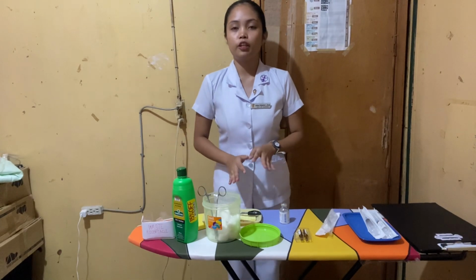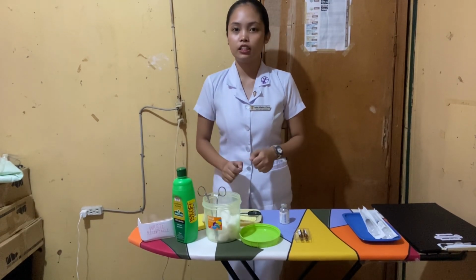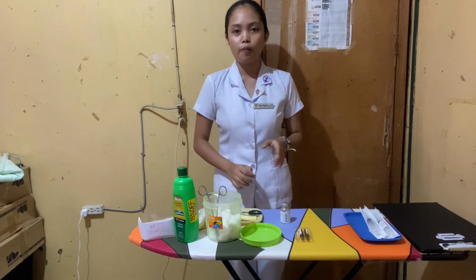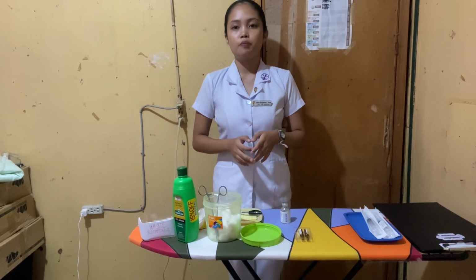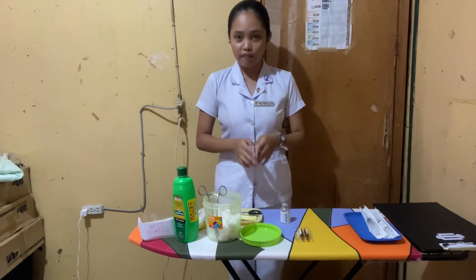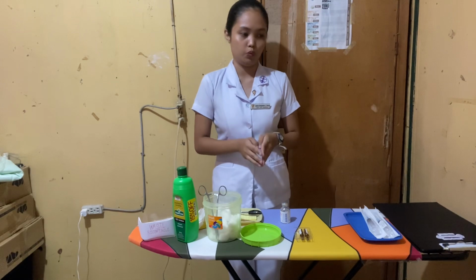Now I'm going to proceed to the preparation of the medication in an ampule. What I'm going to do is prepare my syringe. So I have my 5cc gauge 23 syringe here for my intramuscular injection. I'm now going to open the package, and since my syringe comes with a needle, I'm going to loosen it first so that I can connect it to an aspirating needle. An aspirating needle will help reduce the risk of having glass inside the medication. So I'm going to connect my syringe to the aspirating needle and make sure that the connection isn't loose.